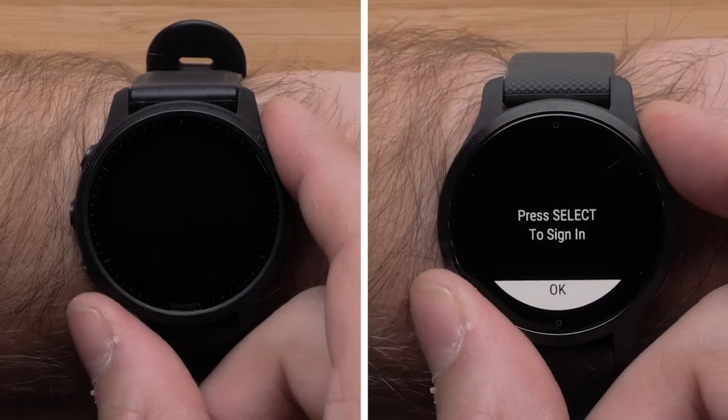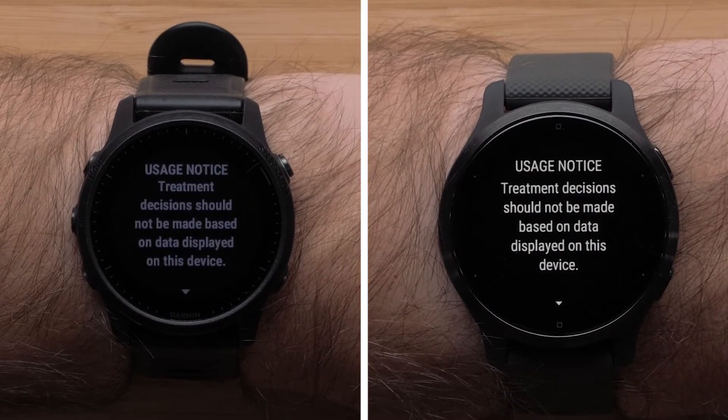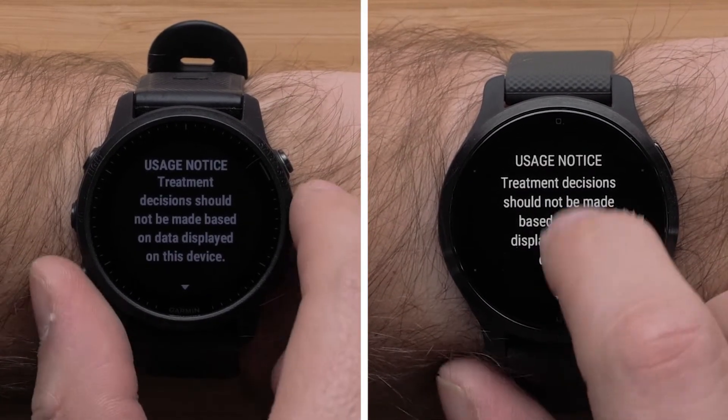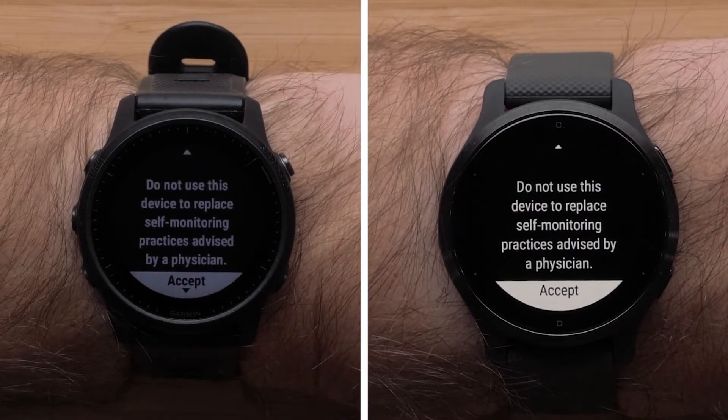Press the Start button to begin the Dexcom sign-in process. Scroll through and accept the usage notice.